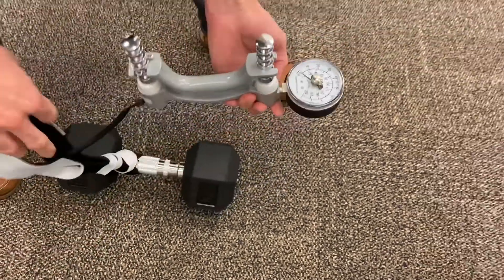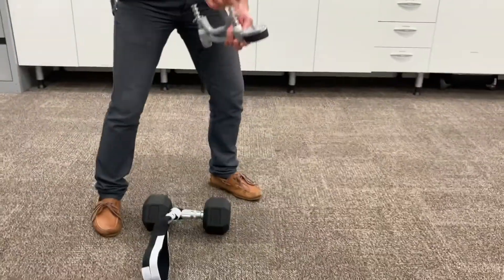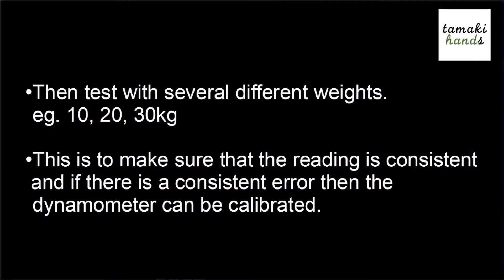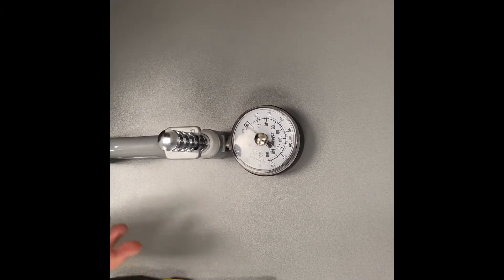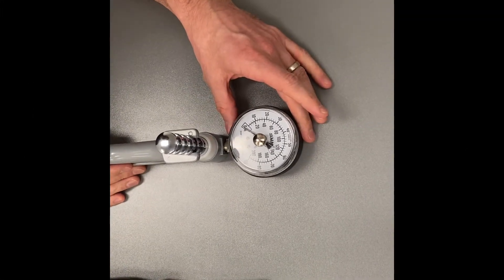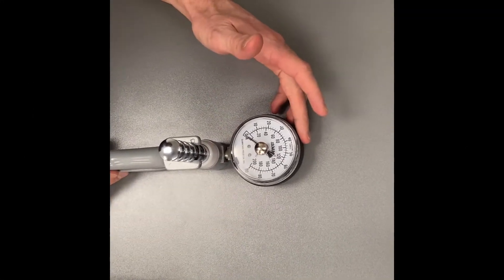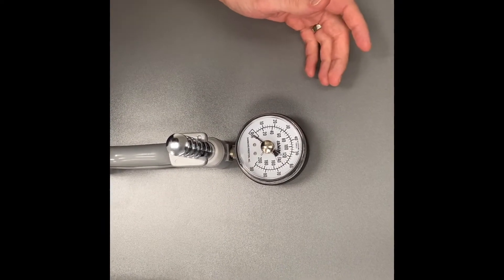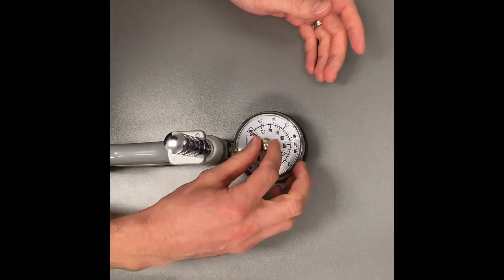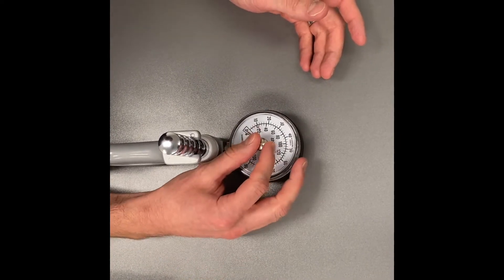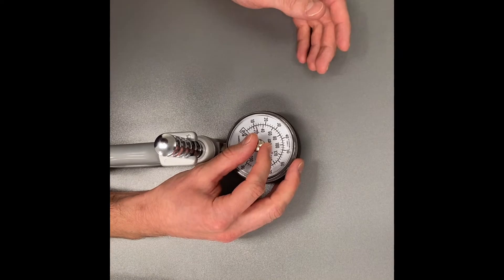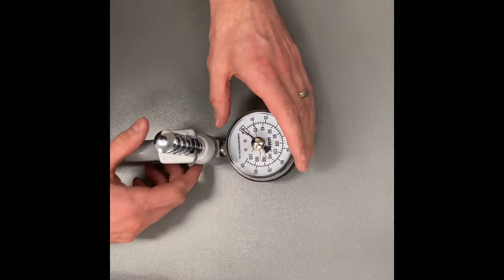We're just going to now show how you might go on to recalibrate the dynamometer after let's say you've found it out to be out by a couple of kgs. So let's say it was maybe a couple of kgs too high, we measure it with a 10 kg weight. We're going to try and just bring that down a little bit.